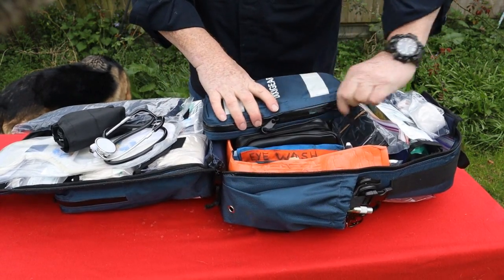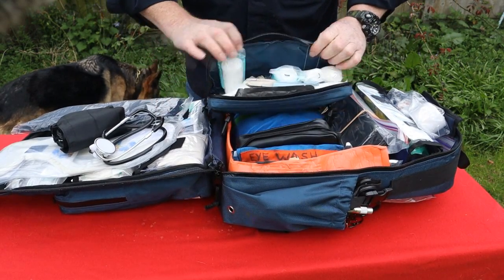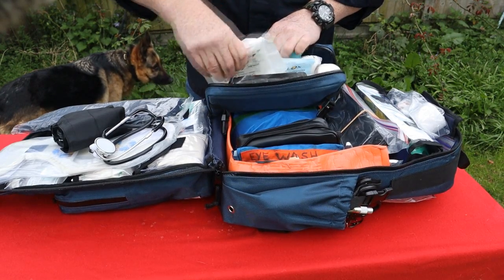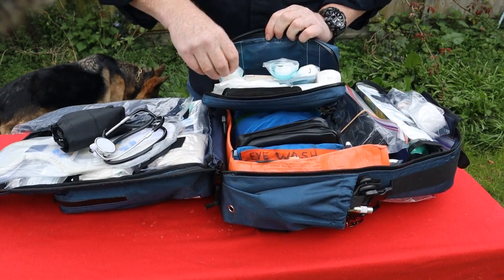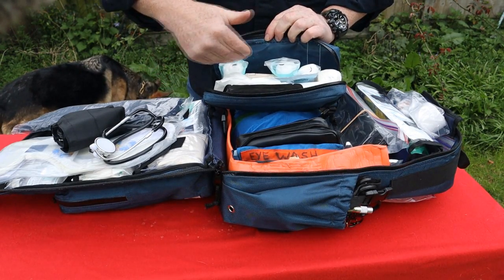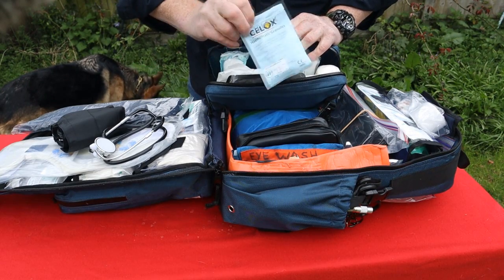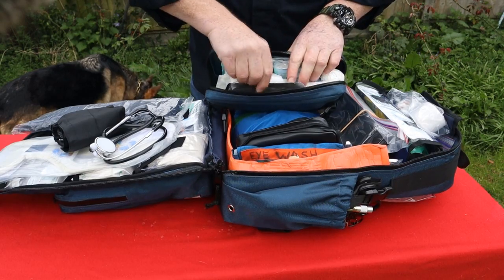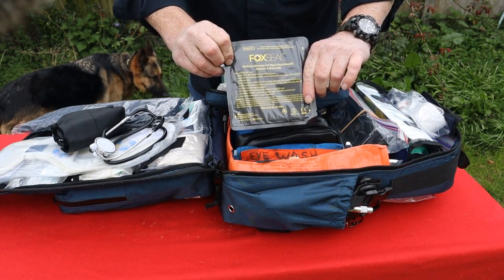This kit here is just my kind of hypovolemia kit, you know, so this is big, loads and loads and loads of sterile gauze, ambulance dressings and bandages. I've got some QuikClot, so clotting agent. There are 2 or 3 different types. The other thing I keep in this bag is chest seals, a couple of those.